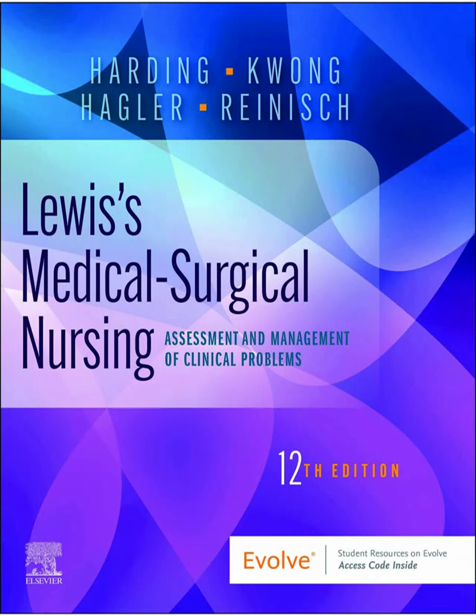Exactly right. After you meticulously go through those steps, find the P wave, check the rates and rhythms, measure the intervals, look at the ST segment, then you ask the big questions. What is this rhythm? What does it mean for this specific patient right now? And what's the right treatment? That critical thinking pathway is fundamental for the NCLEX and definitely for real-world nursing. You can't just treat the monitor, you treat the patient.